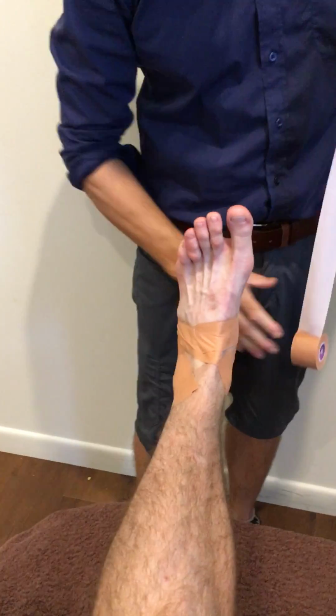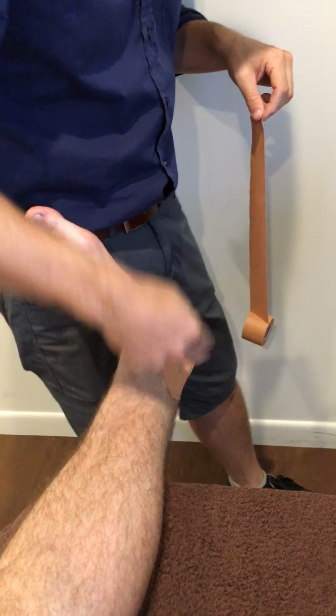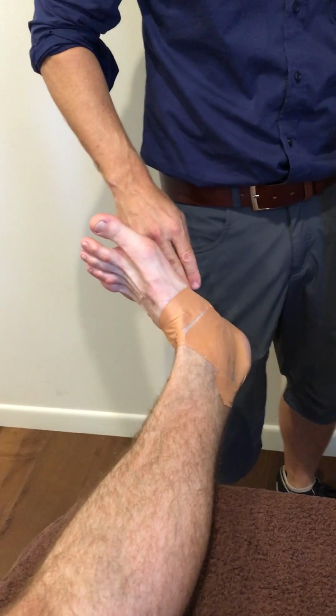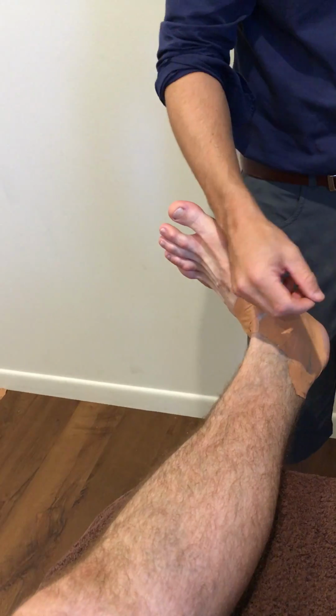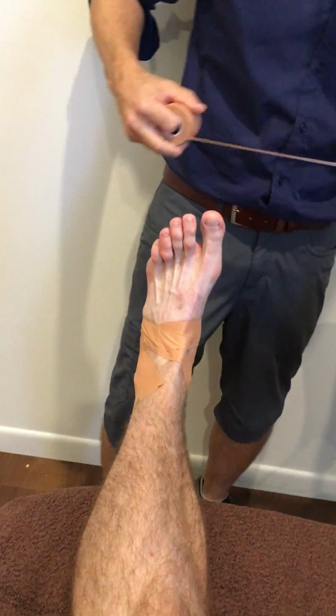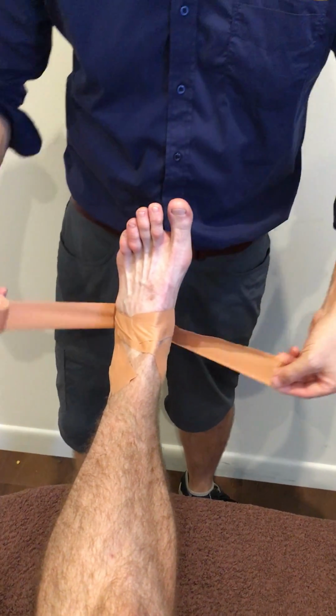And if it feels too tight to her, you can cut a little bit up here, and then sometimes in there, and a little bit in there, and see if that helps. Otherwise, take it off and start over. So to really lock it in, a figure 8.